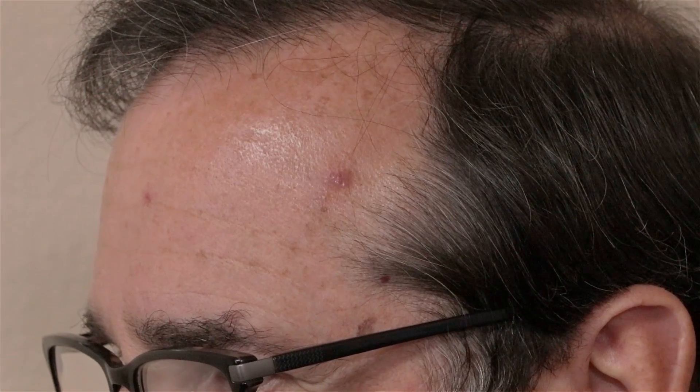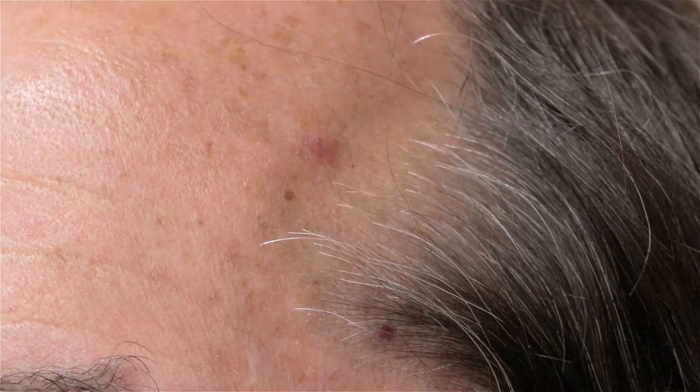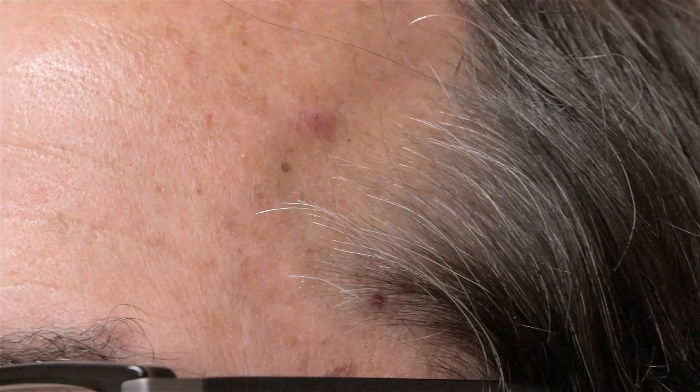They may be something, they may be nothing, but this one — when looking at it under magnification — I can see it's got some raised edges to it, which makes us concerned for a potential type of skin cancer. Thankfully, the type I'm concerned about is the very easy to treat type: basal cell carcinoma. Sometimes a squamous cell carcinoma can masquerade as a basal cell, so that's why we want to make sure by taking it off with the shave procedure.